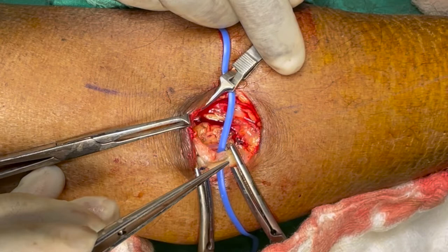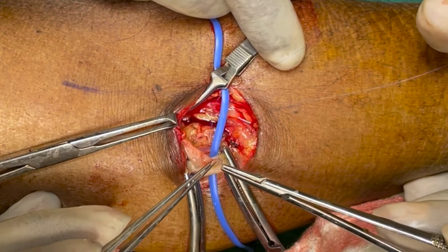Once we reach the foot end of the anastomosis, we should be more careful not to include the posterior wall of the artery.